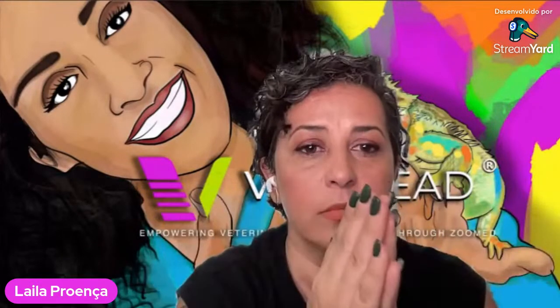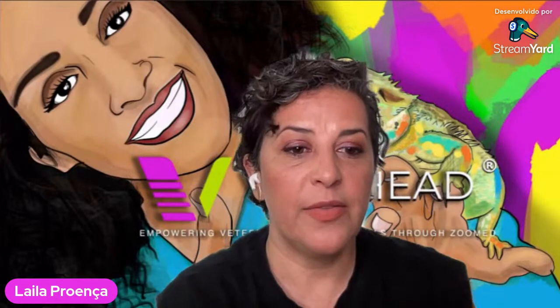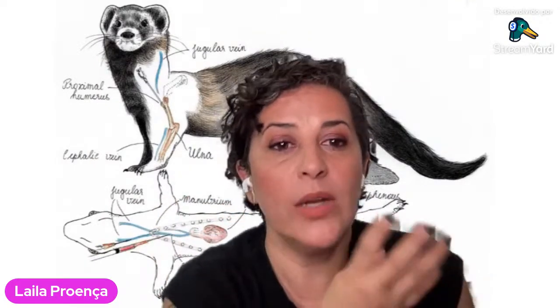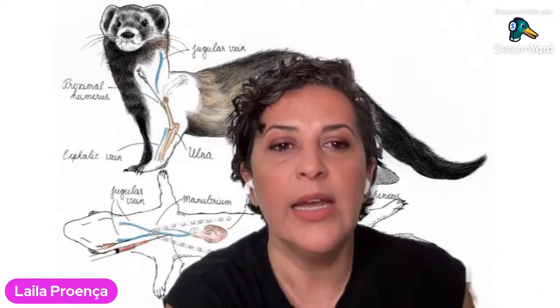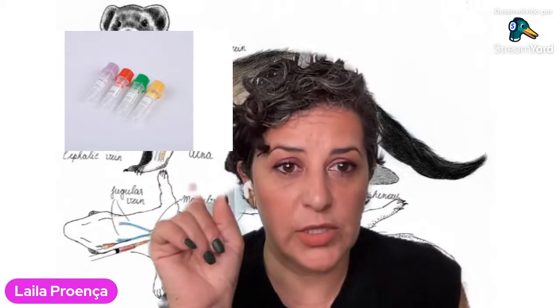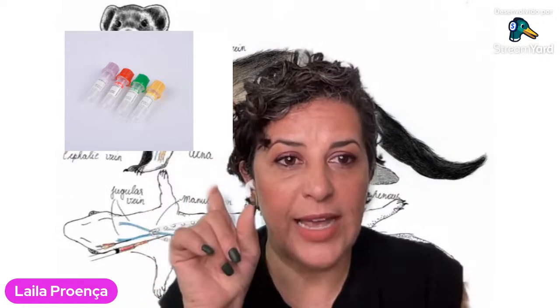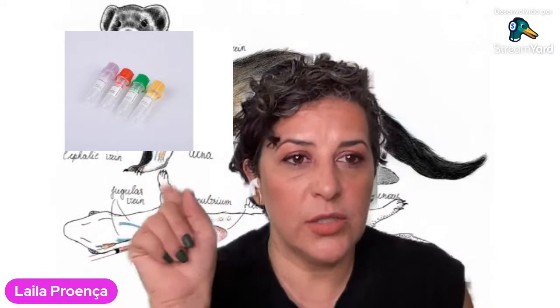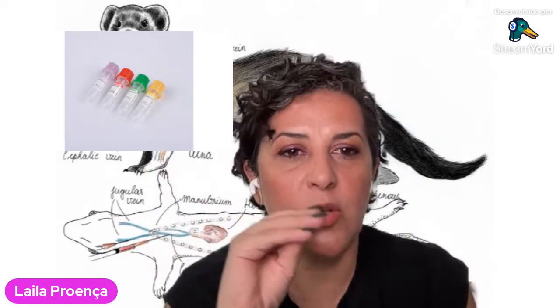Okay, so let's start with mammals. The small mammals, so I'm talking about rabbits, chinchillas, guinea pigs, rats, mice, etc. For those, we're going to follow the same standards that we have for dogs and cats. So when you want to run a CBC on a ferret, what you're going to do is lavender for CBC, and heparin or the serum separator for biochemistry. On those microtubes, the serum separator is usually the yellow one, this is usually in the United States. The dark green is heparin, and the lavender top, that light purple, is EDTA. So that's what we're going to do for mammals.